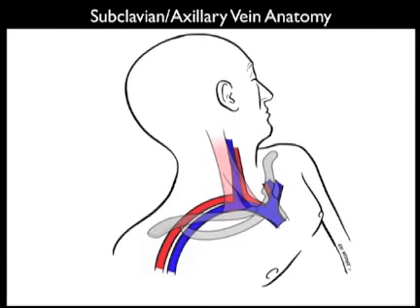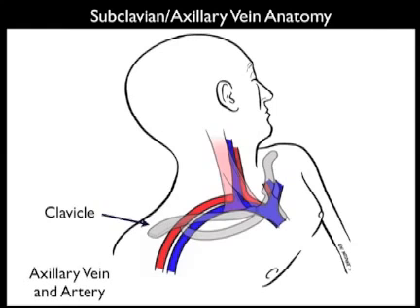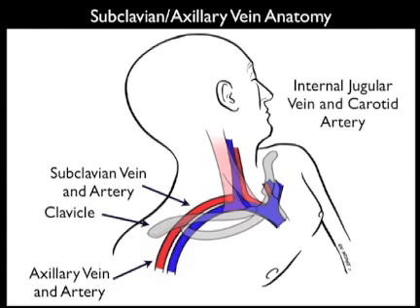Here's another anatomical image showing a perspective from a more lateral orientation on the patient's chest wall. Here we see the axillary vein and axillary artery, and notice that the normal orientation of the vein and the artery is that the artery should be superior to the vein, although occasionally we have seen some variation, and it's not unusual for the vein to be overlapped by the artery or vice versa. We see the continuation of the axillary vein and artery onto the patient's chest wall medially to become the subclavian vein and artery as the vessels pass medial to the first rib. We also see the internal jugular vein and carotid artery and the superior vena cava.